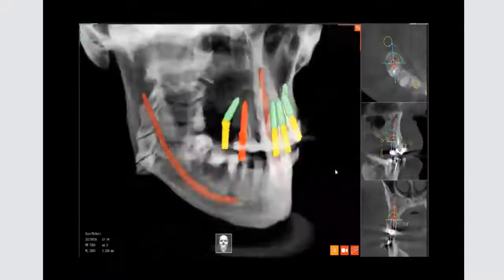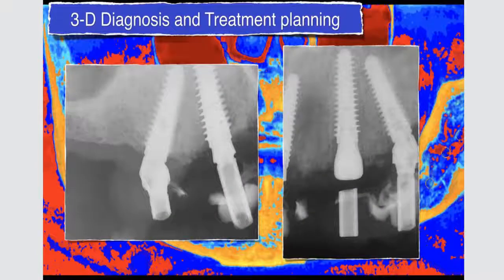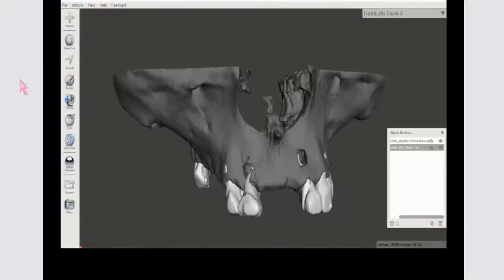has the right components. And so we have the technology to be able to do this, to be able to zoom in, to be able to appreciate. And I'd like you to pay attention to some of these implant placements, and you can see the multi-unit abutments here. And you can visualize, in this case, in the left-hand screen, that there is an emergence for these multi-unit abutments to re-angle, and therefore we have to make sure that they're not impinging on either soft tissue or bone.